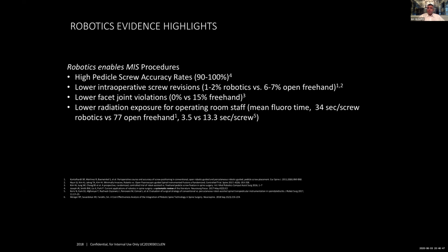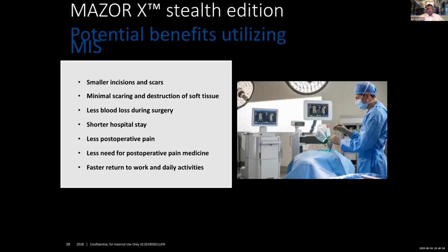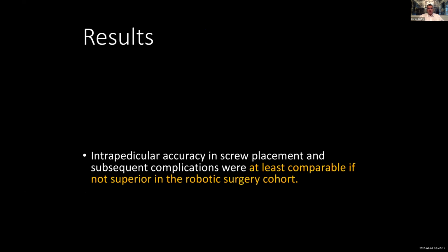And before I put the screws percutaneously, I take another PA view just to see the position of the K-wires, and then I fire those screws. Very effective, with very little fluoroscopic time. So just what we all know with MIS: smaller scarring, smaller incision, less blood loss, short hospital stay. All that, we're just talking about the same thing.